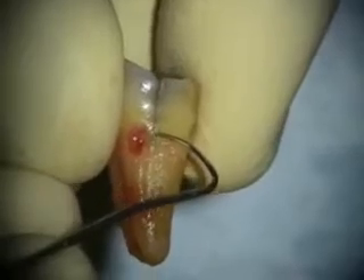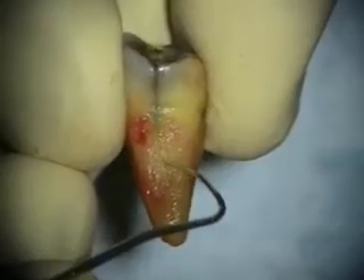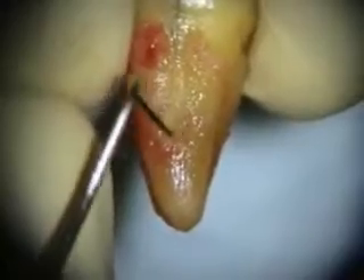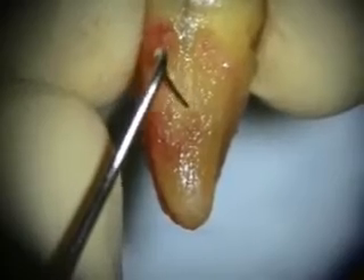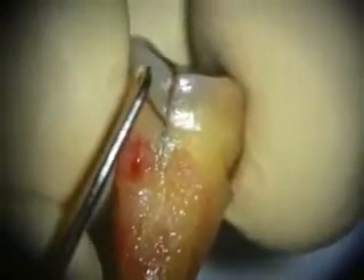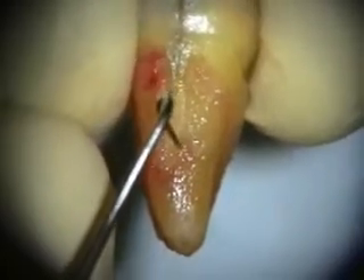You can see a fracture on the distal here and it's gone down past the CEJ. It's really hard to see, but it's worked its way more apical and you can see the attachment loss associated with it all around here. There's a fairly visible fracture, and as it goes more crumbly you can see this is an older part of the fracture going to this new part here.